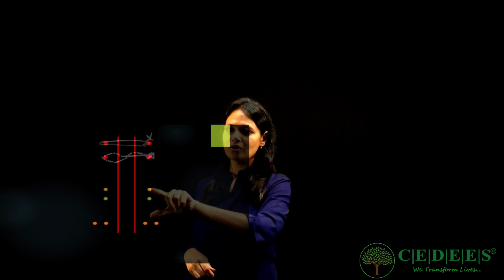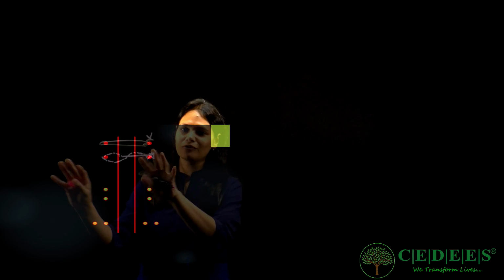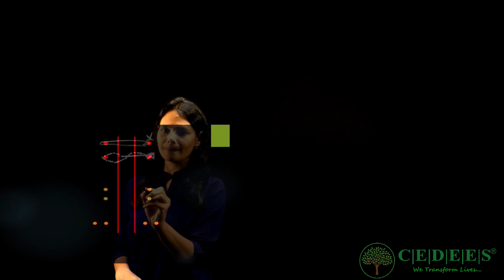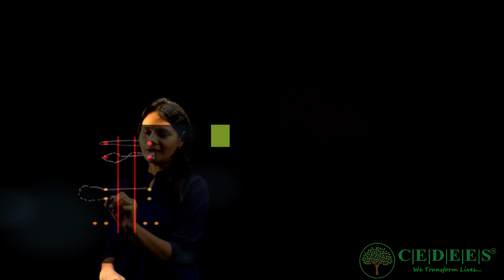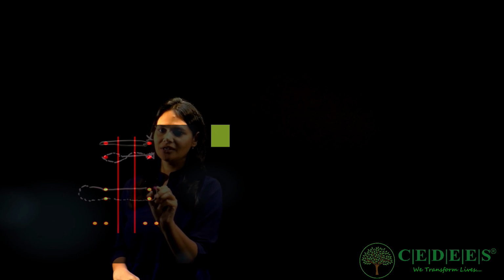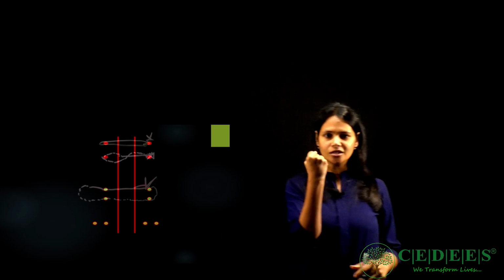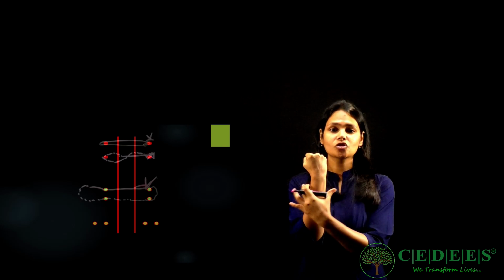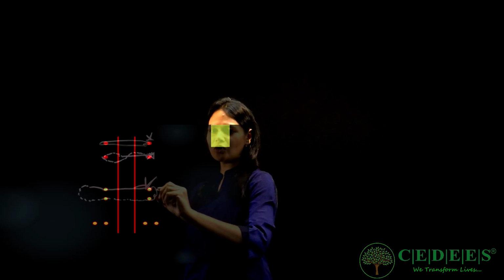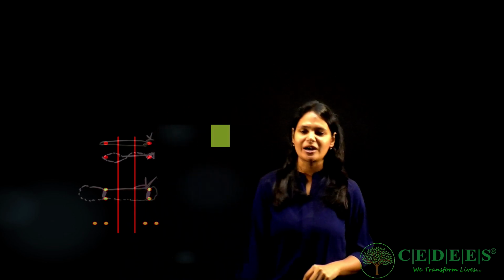Now if you remember my description from the previous slide, this is how your horizontal mattress will look and this is how your vertical mattress will look. This is your buccal flap, lingual flap. So you start from here, go here, come out, pierce again, go here and then come back and tie a knot. So this is your horizontal mattress. On a single tooth, you will have 2 piercings on each side, mesial and distal. That is your horizontal. So if you look from outside, it will look like 2 lines, one here and one here. So this is your horizontal mattress suture.